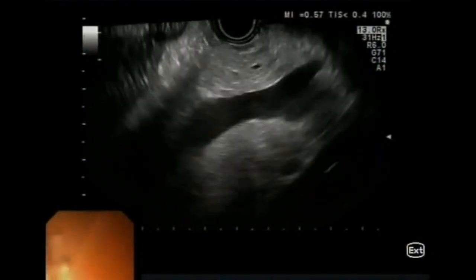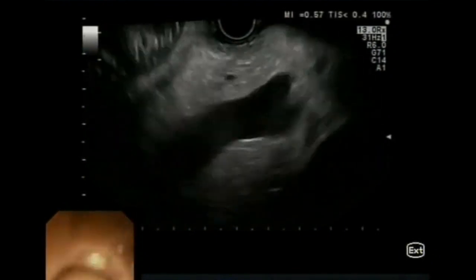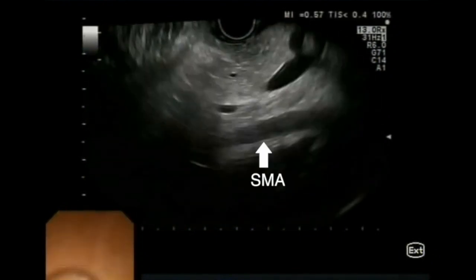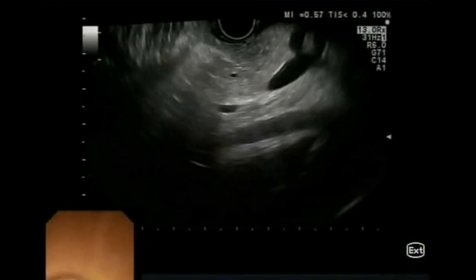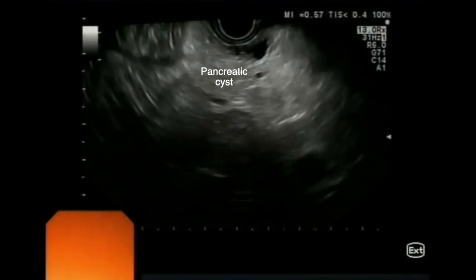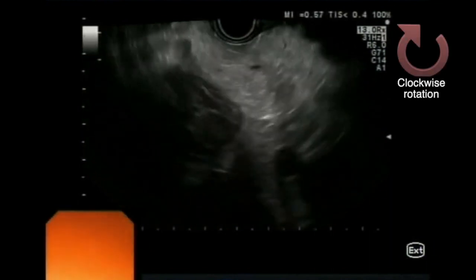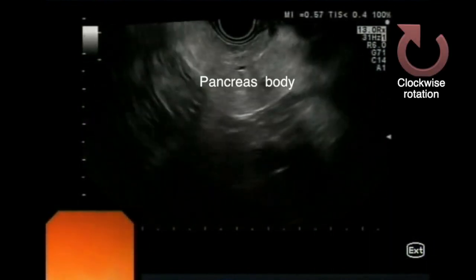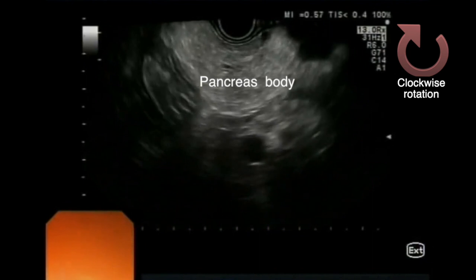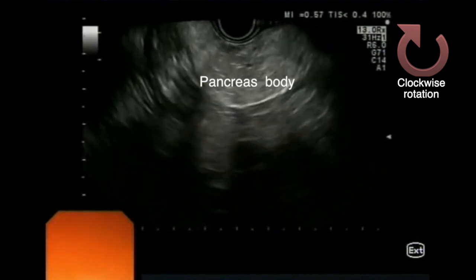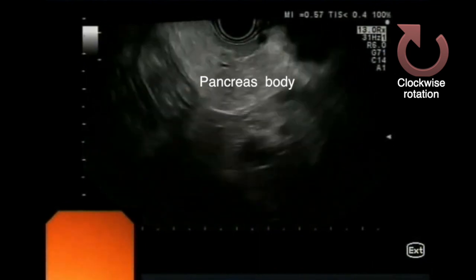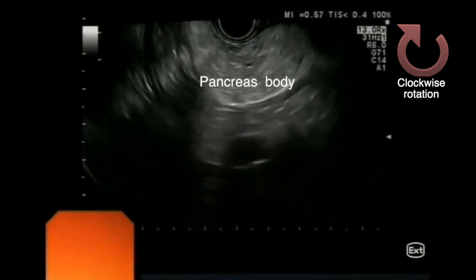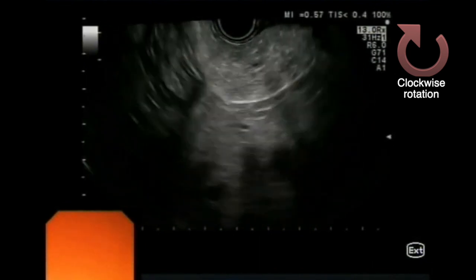In the bottom of the screen, we can see the superior mesenteric artery running parallel and distally to the superior mesenteric vein. And if we rotate clockwise a little bit, the body of the pancreas comes into view. We can clearly see the PD, which is followed to the tail by rotating clockwise and slightly withdrawing the scope.